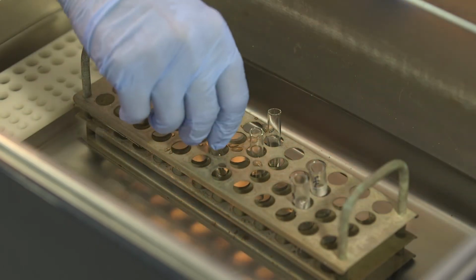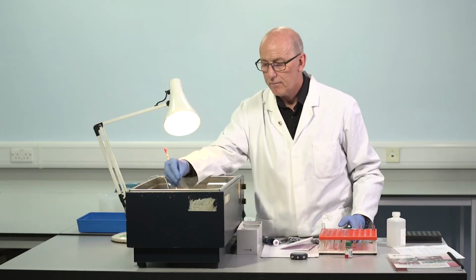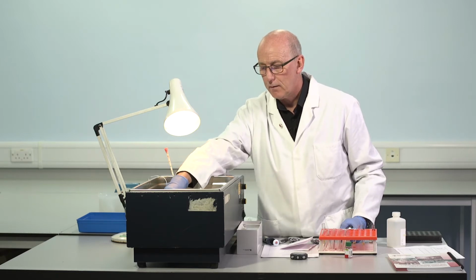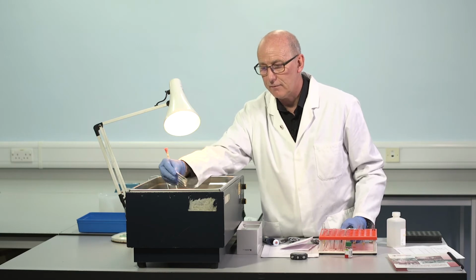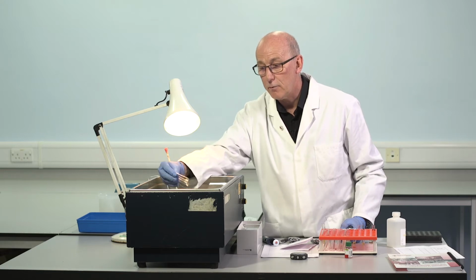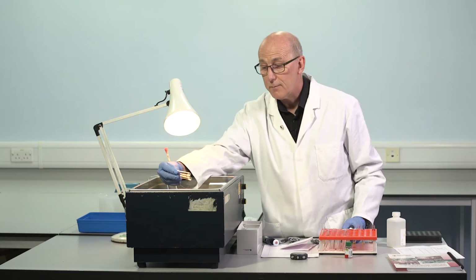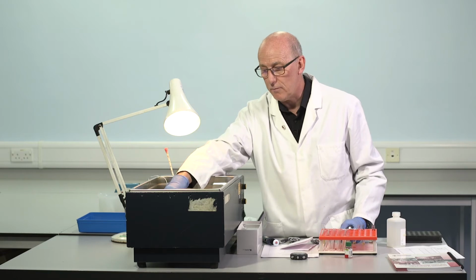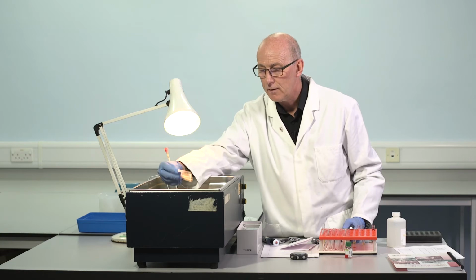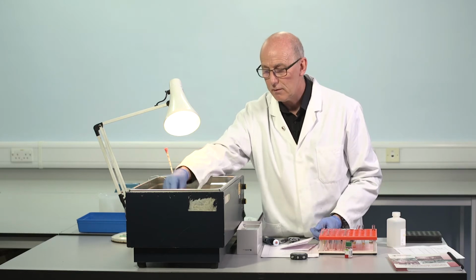So now we need to observe these tubes for clot formation. And this involves, we've got a balance to pay attention to. We want to keep the temperature as close as we can to 37. We know that these reactions are temperature sensitive. Therefore, we want to keep the mixtures immersed in the water as much as possible. But at the same time, we want to observe the clot formation. And of course, it's important to try and do this accurately. This will have an impact on the results which we obtain. First tube's clotted. So we've got this balance between maintaining temperature and observing the clot.